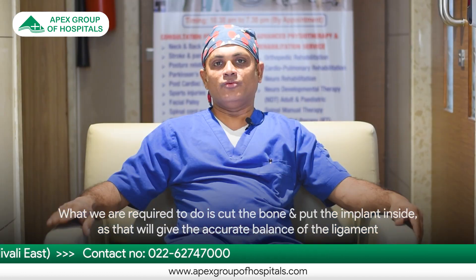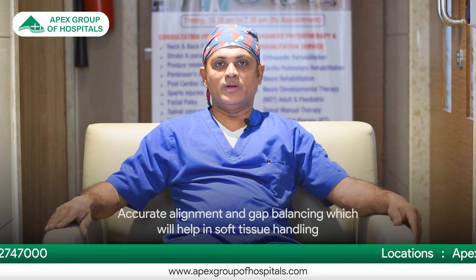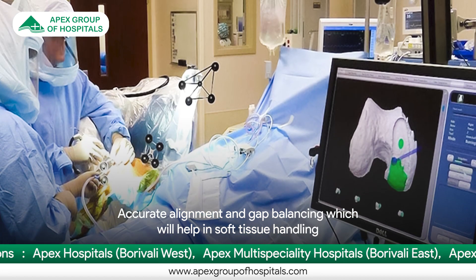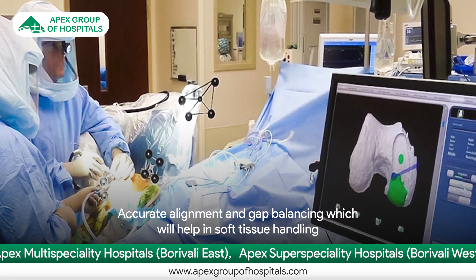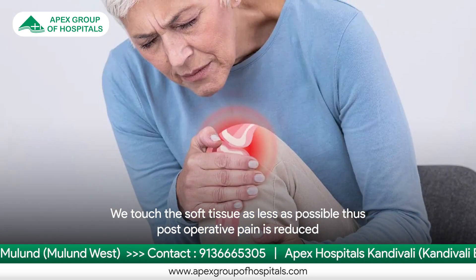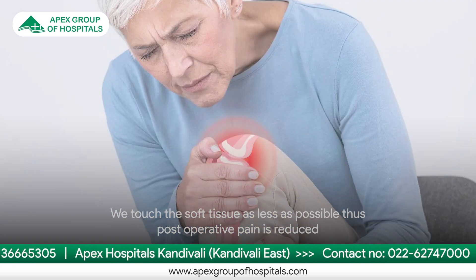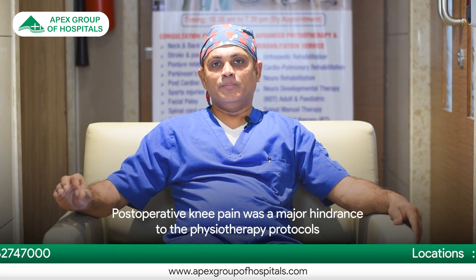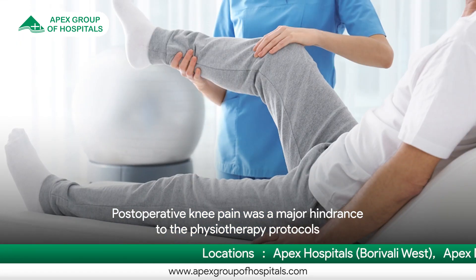This will give us an accurate balance of the ligaments along with the accurate alignment and gap balancing, which will help in a minimum amount of soft tissue handling. Now when we touch the soft tissue as little as possible, post-operative knee pain is reduced to a very great extent. This post-operative knee pain was a major hindrance to physiotherapy protocols.